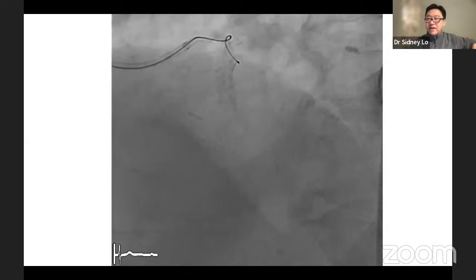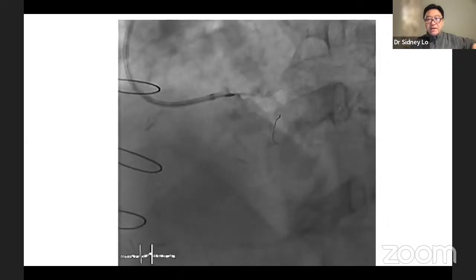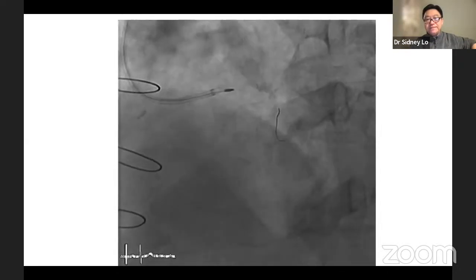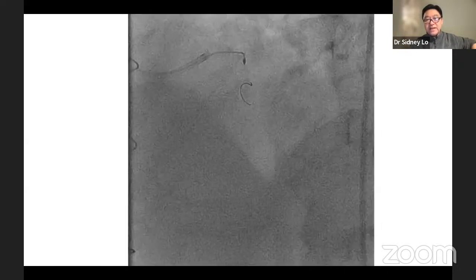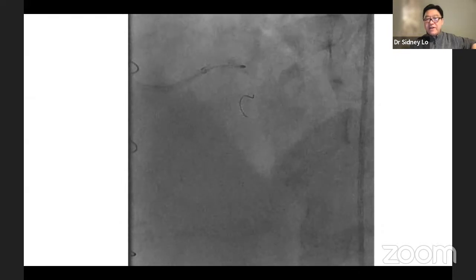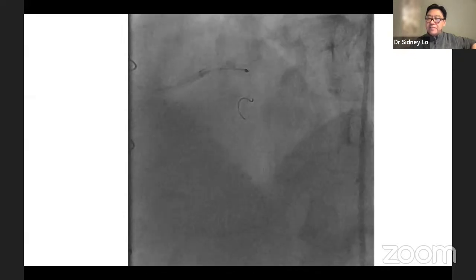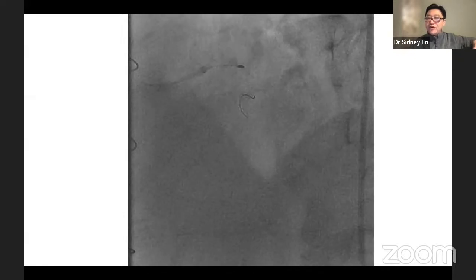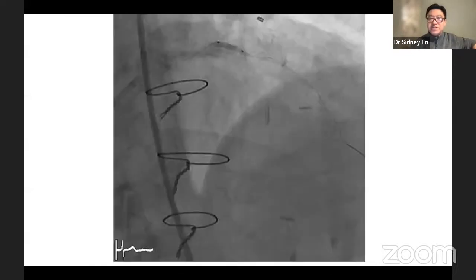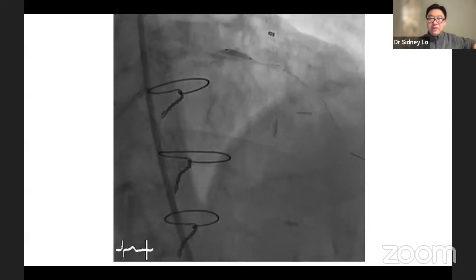This is a relative contraindication to rotational atherectomy. We persisted though. This is a 1.25 millimeter burr. You may say that's not very big, and that's true. This is some approach at cutting. And there is an increased risk of rotating off the distal tip, because usually it can jump forwards on the run. But we were lucky. Exchange.